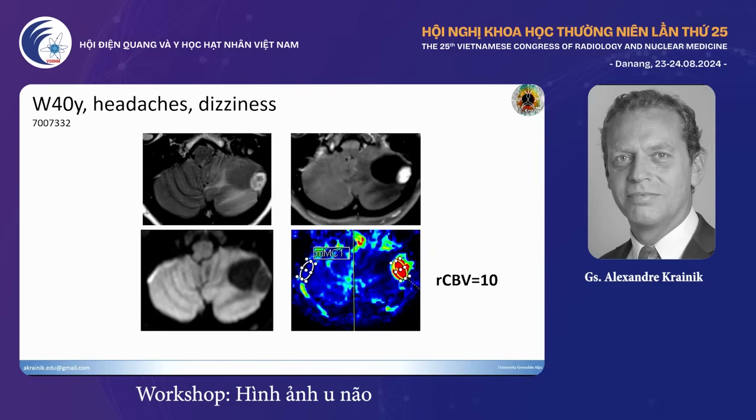And we saw that normal brain is roughly 4 or 5%. When you have 10 times more, it means that about half, 50% of your voxels, half of the quantity of the voxel is cerebral blood vessel. Then it's roughly a hemangioblastoma or something like it, okay?